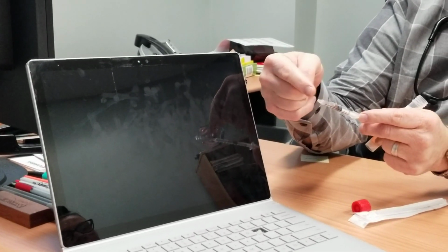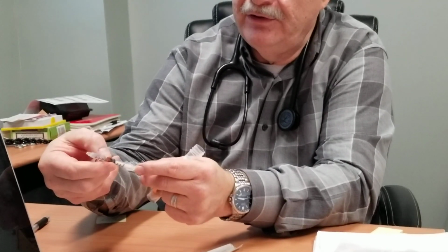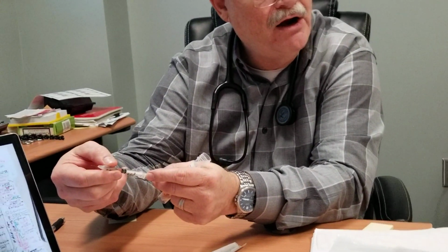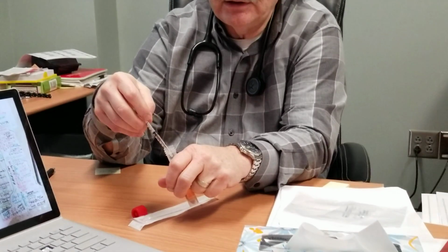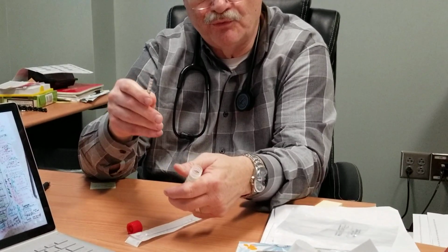The fluid that you're collecting will probably be in the needle and maybe in the very beginning of the hub, but now that you've got a fluid media behind it, rather than just depending upon the air to express it out, you've got the fluid, and it'll actually push it back, and you just inject it back in here. So you don't actually need to use the swab, and you don't have to rub, and the patient's going to be much more comfortable having had it sampled.